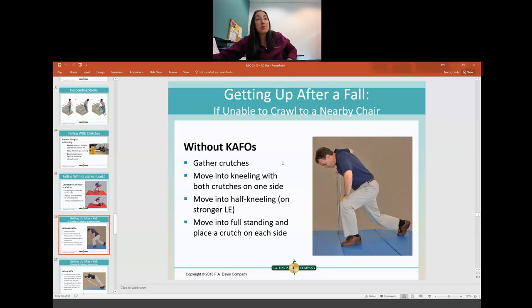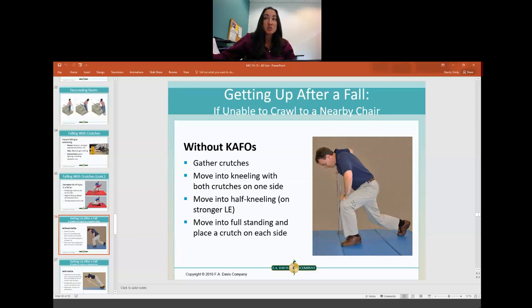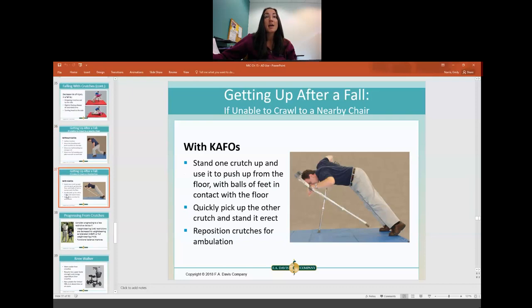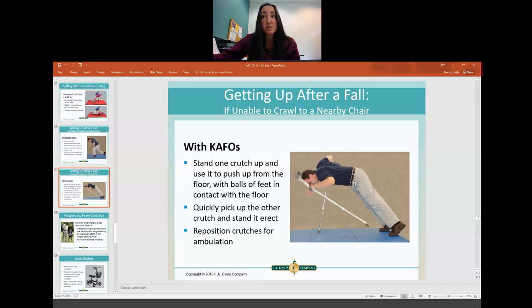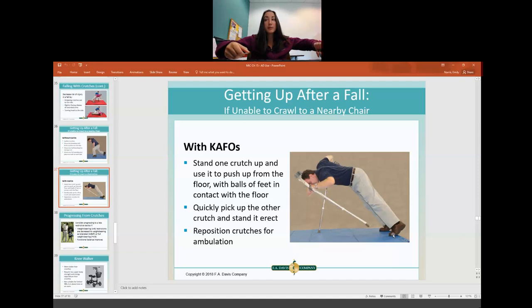If the patient does fall, teach them to drop their crutches, bring their arms out to the side with elbows slightly flexed, and turn their head to the side to protect their head while falling. To get back up after a fall — if they don't have KAFOs and can bend their knees — they can crawl to a nearby chair, bump themselves up to it, and stand from there. If not, they gather their assistive devices, put them both on one side, get into a kneeling position, then half-kneeling, and push themselves up to standing. With KAFOs keeping the knees in extension, it's even harder — they grab both assistive devices, straighten their legs, go into a downward-dog position, push their hips up, and once the weight is on their legs, quickly move the crutches backwards to standing. It's impressive but takes a lot of strength and practice.